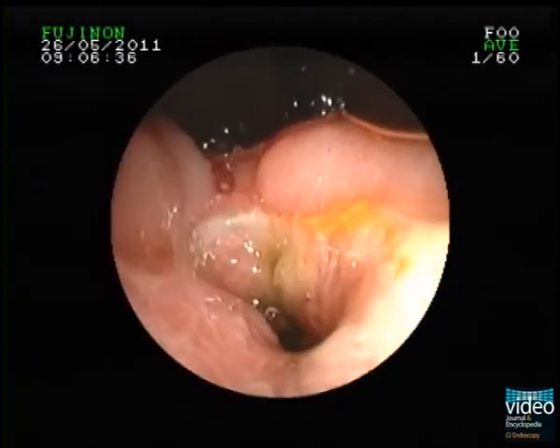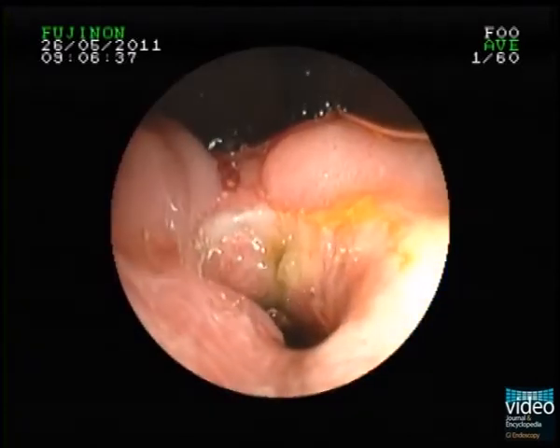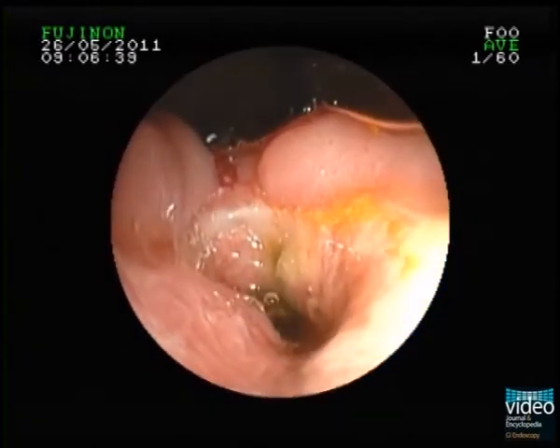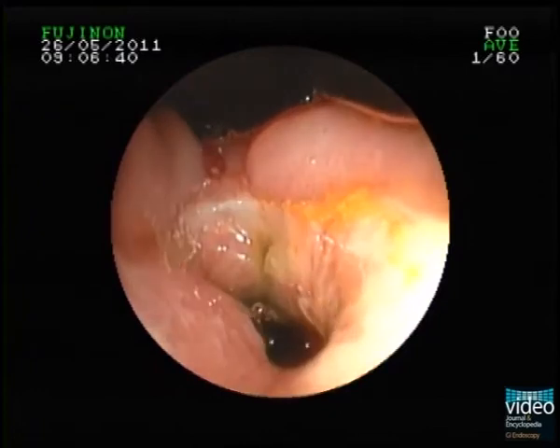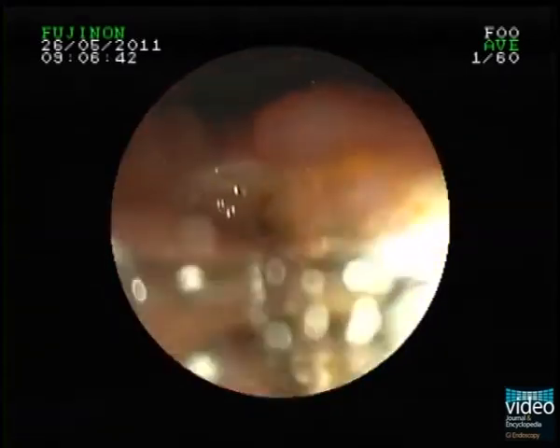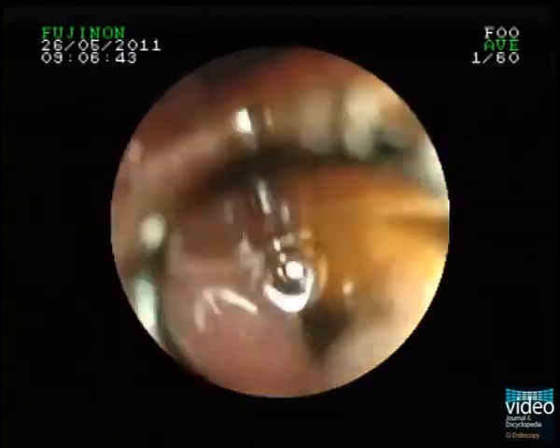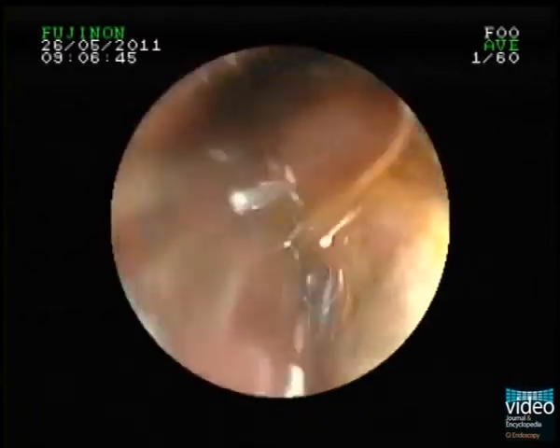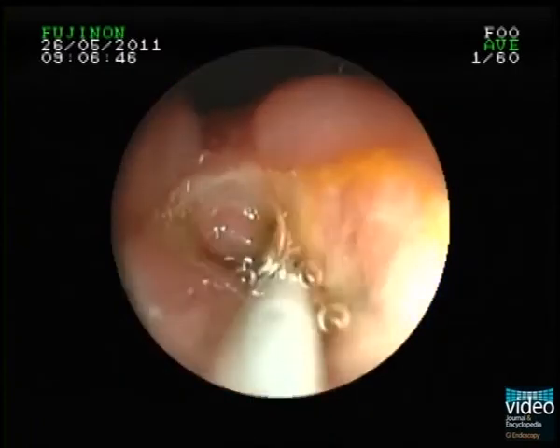The endoscope is advanced by the transnasal route, and a J-turn is performed in the duodenum so that the tip of the endoscope is positioned facing the papilla, which is wide open after previous sphincterotomy.